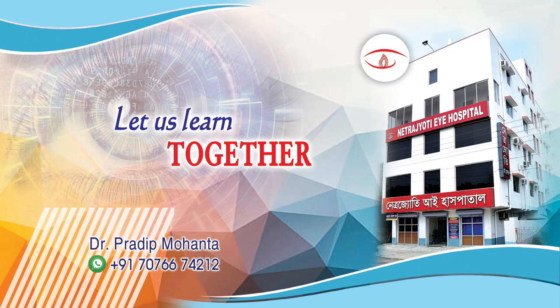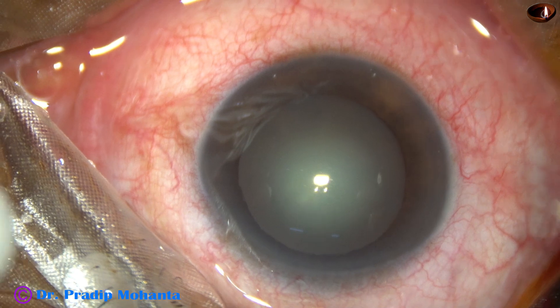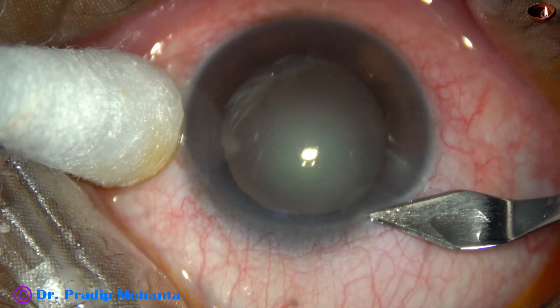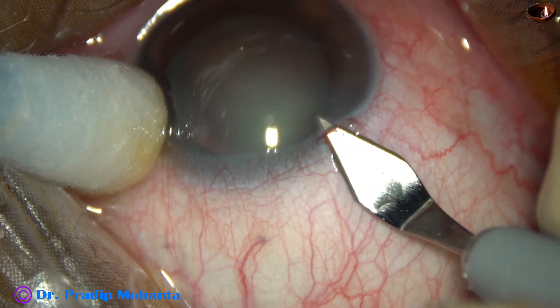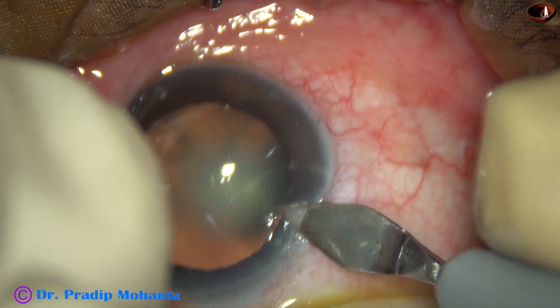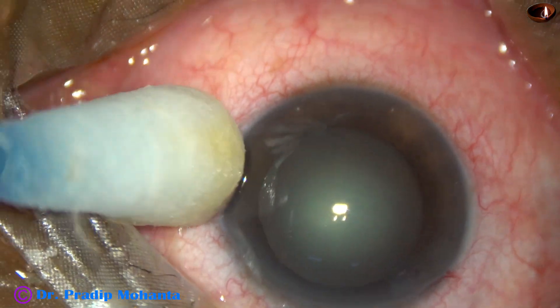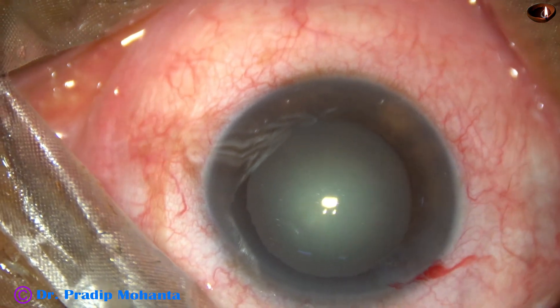Through this video we are going to learn the stop and chop technique. This is a cataract with grade 2 nuclear sclerosis, a cataract of ideal density for beginners. This is how the main incision is made — a tri-planar incision using a steel keratome, a 2.8 millimeter incision at mid-limbus.